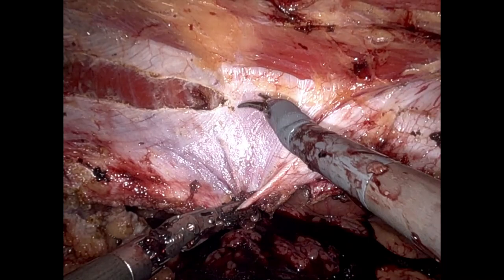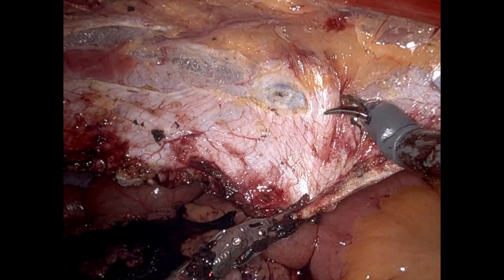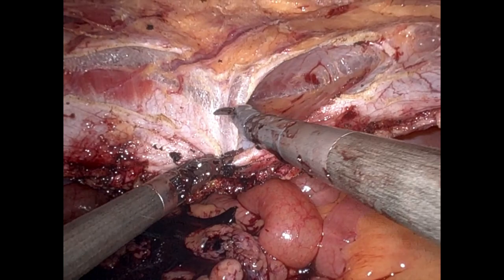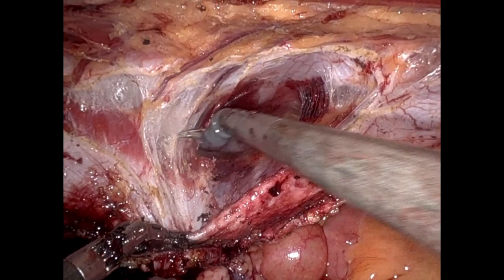On the left side of the TAR, what you're seeing here is incising the posterior lamella of the internal abdominal oblique, exposing the transversus abdominis muscle. As we go caudal, the muscle goes lateral and we're left with just the tendinous portions of the transversus abdominis. This is a combination of pre-transversalis and pre-peritoneal dissection, working in that retromuscular space and assuring that no muscle is left on the peritoneum or posterior sheath.